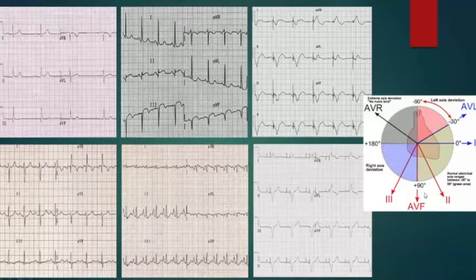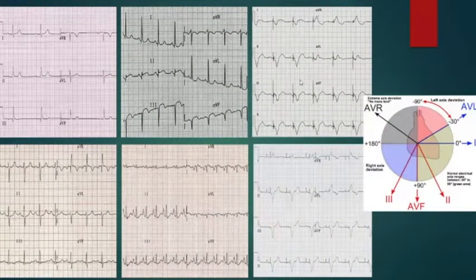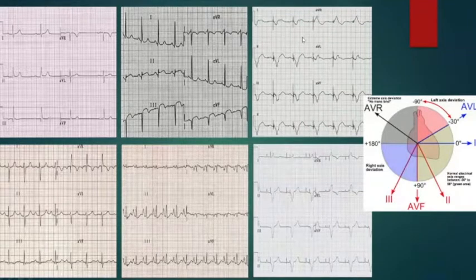So let's skip that example and go to this one. Somebody tries. I can try. Please. So, almost equiphasic first lead? I think we have a positive first lead. Here, this example. The third up. Is the first one biphasic? No, I don't think so. This is the T wave. It's not the only biphasic lead. It's this one. So there's something going down and then up.